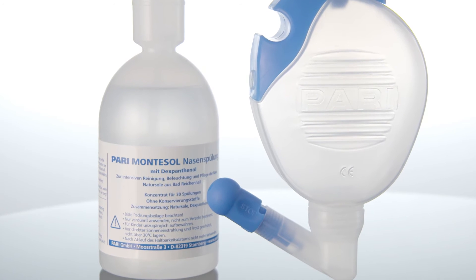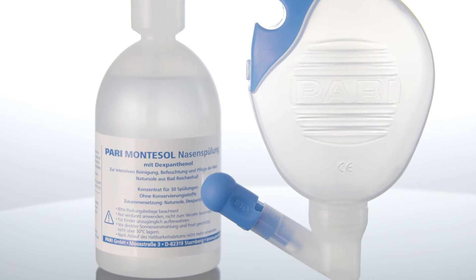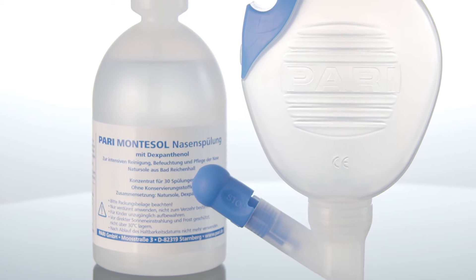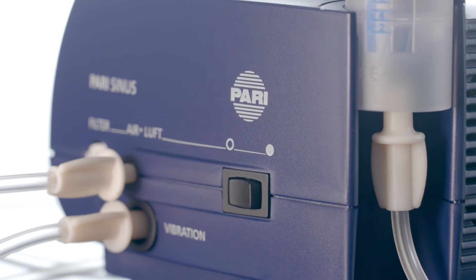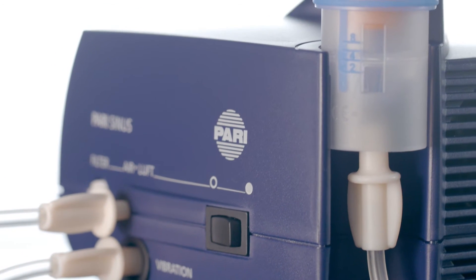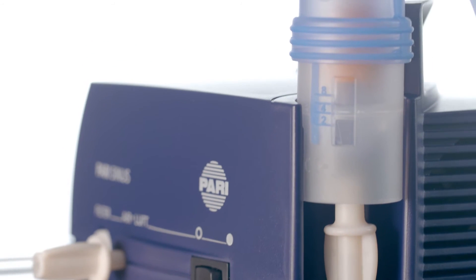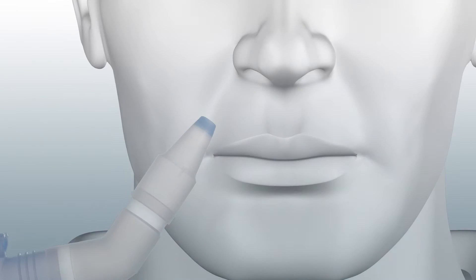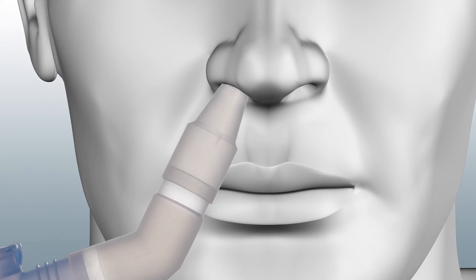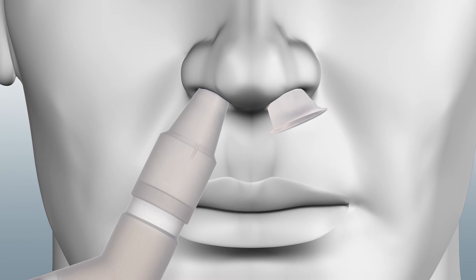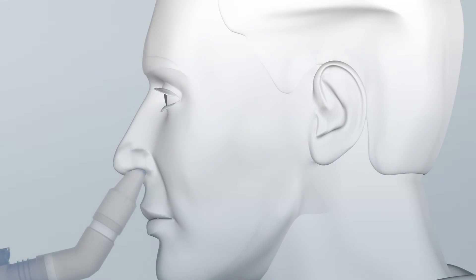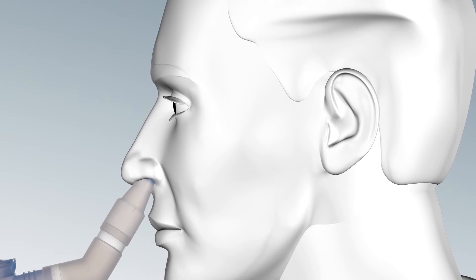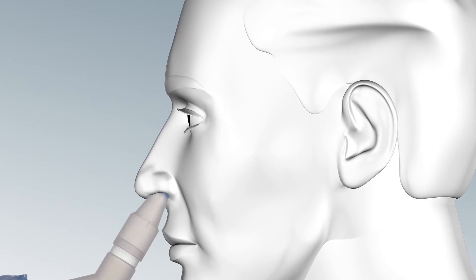A nasal rinse such as Paris Montisol should be used prior to starting therapy with the Paris Sinus. Once your nose is clear, the therapy can begin. Start by inserting the nebulizer just inside one nostril, and then insert the nasal plug provided into the other nostril in order to ensure that the saline or medication is able to reach your sinuses.